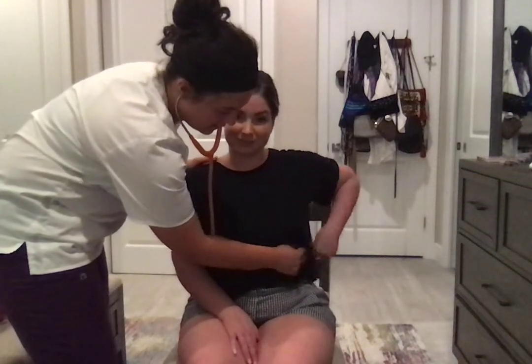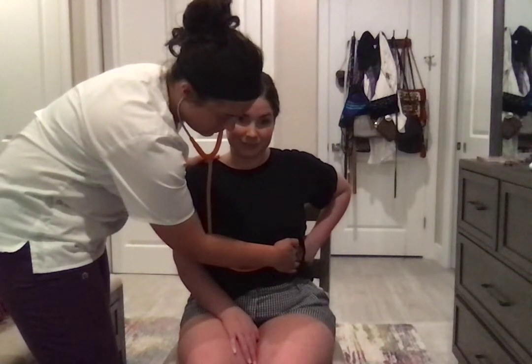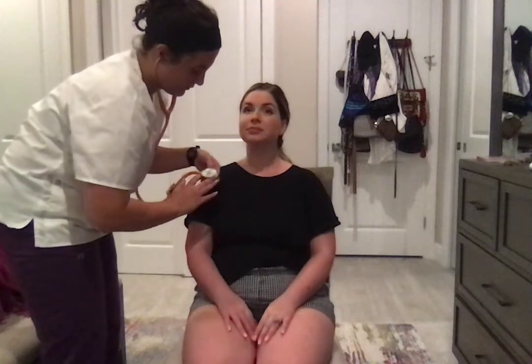And she has a small torso, so I'll be listening to the lower lobe back here. And it would work best, obviously, if her shirt was taken off. But we're not going to do that. Okay, good. Now I'm going to do it with the bell, please. Sorry. Okay, you're good.